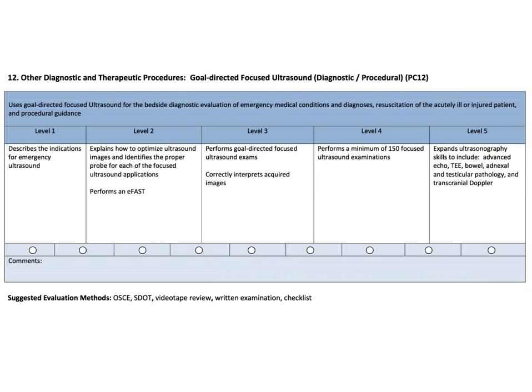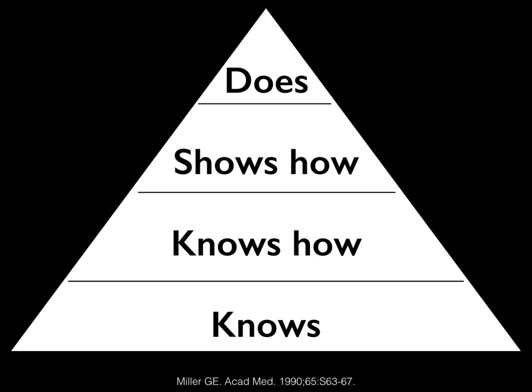And we're all involved with education of residents in ultrasound or medical students. We're all teaching people. That's part of why we're here. But when you assess people, this brings up a whole different paradigm. And some of that is involved with Miller's framework for clinical assessment. And you can see this pyramid that we assess people's level of knowledge at different levels, bringing them up to the level of what he calls does.